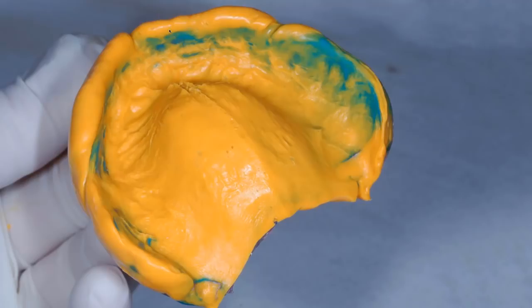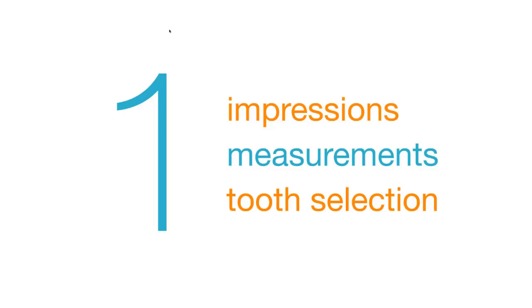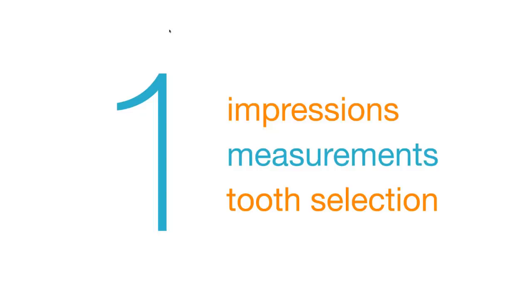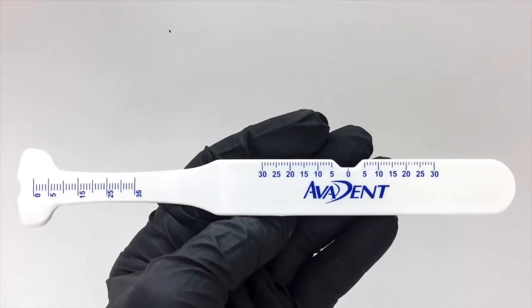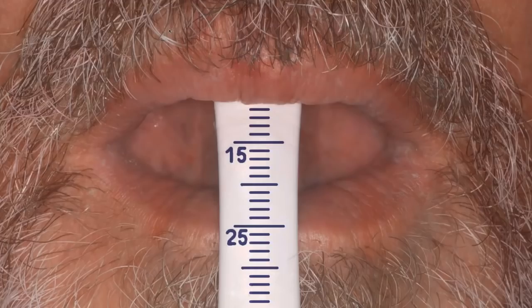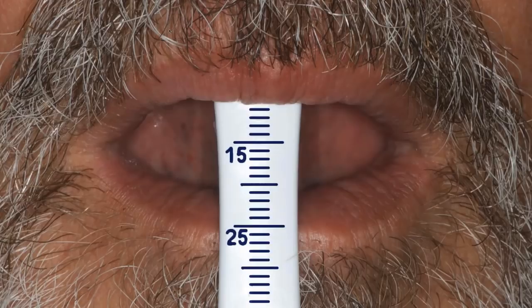Now for measurements. We're going to take several measurements of the face to record and send to the laboratory with your impressions. We'll use a device called the Avometer by Avident — very similar to a traditional papillometer used since the 1930s, but with additional measurement capabilities. Take a measurement from the incisive papilla, which usually sits right behind the central incisors and is pretty obvious in the edentulous ridge. Place the papillometer on the incisive papilla, have the patient drape their lip to a relaxed position, and record that measurement — typically about 13 or 14 millimeters.